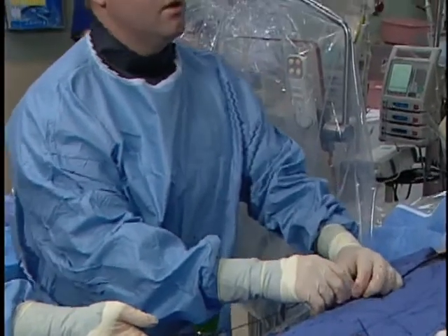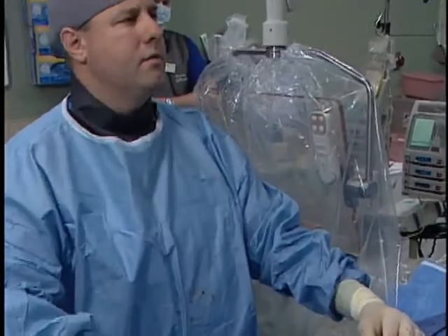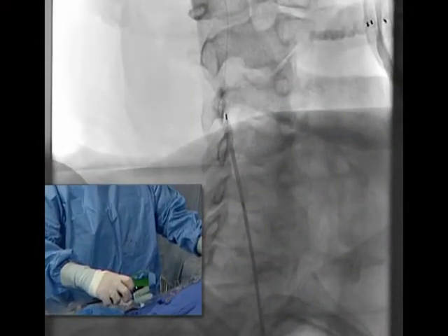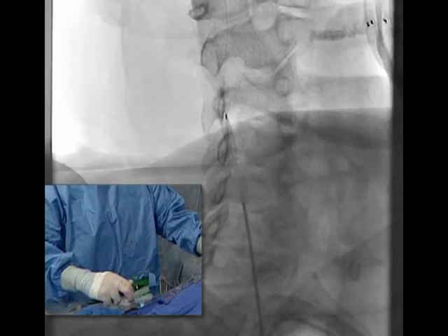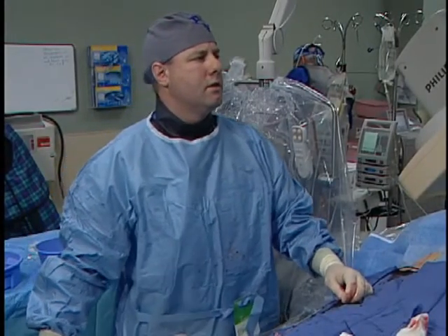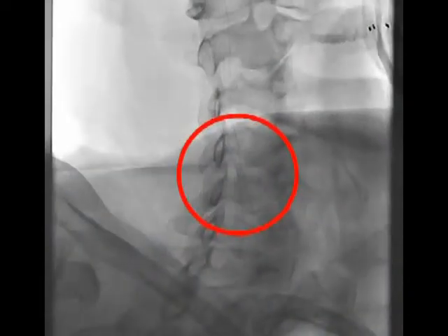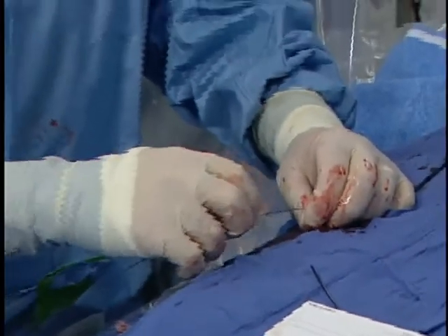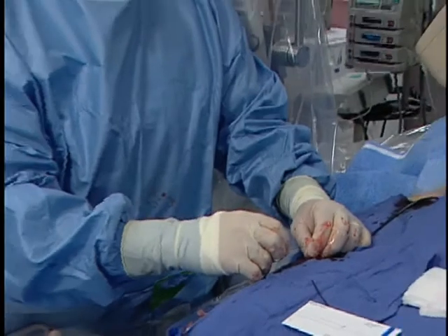We're going to deploy this right here. You'll see as I turn this handle, the stent will be deployed. Now we'll take our balloon and post-dilate this. You can still see there's still a little bit of an hourglass shape in there, so we're going to make one inflation and put a stent across this and let it endothelialize.